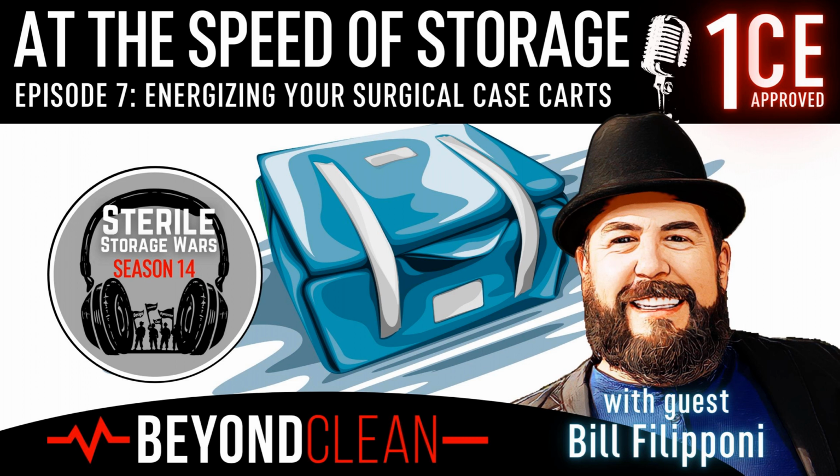Yeah, I think probably the biggest one is when you have somebody maybe moving a case cart that's not used to moving the case carts around, maybe placing them in a spot where they're not able to be found as quickly. Like I stated before, we have a large area in our SPD, but our OR does not have that large area. So they have the ability to house maybe one case cart extra other than the one that they're doing. So there's a lot of movements of case carts when it comes time the day of the surgery. So if someone actually parks a cart in the wrong place that doesn't realize it doesn't go there, carts can get misplaced and lost. And like I said, we track to the cart, not to the OR room. So if someone puts it in the wrong spot, it becomes an issue.